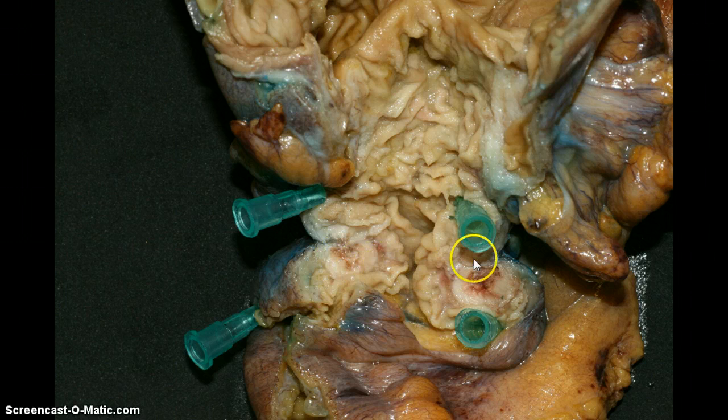There's this stricture here with thickening of the muscle wall, and terminal ileal disease should automatically throw up a differential diagnosis in your head. Automatically, the things I think about with stricturing in the terminal ileum are Crohn's disease and neuroendocrine tumours. They're the main ones. Then there's the scarred-up Meckel's diverticulum.